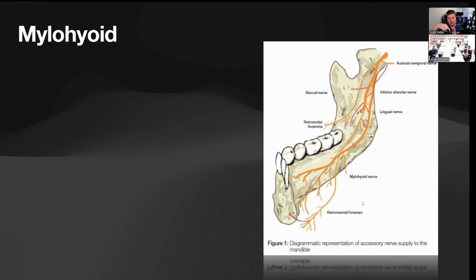When I'm doing my lingual injection, sometimes I'll just pick up the mylohyoid. Have you guys been taught how to do the mylohyoid injection? No, not extensively. Okay, back to the skull.